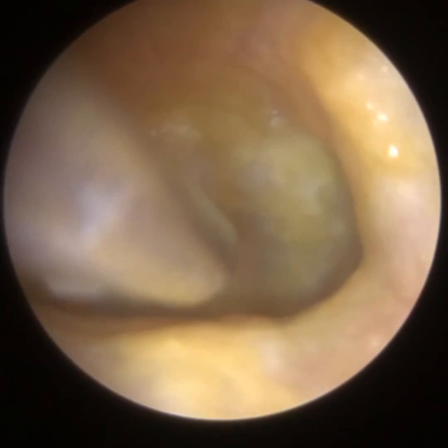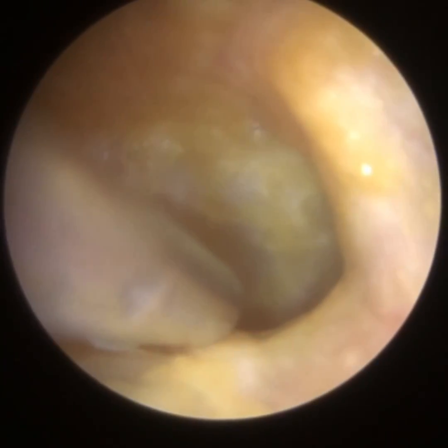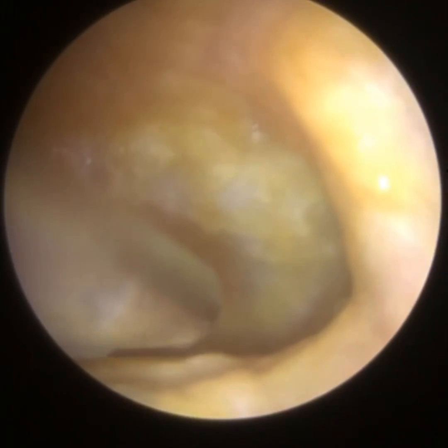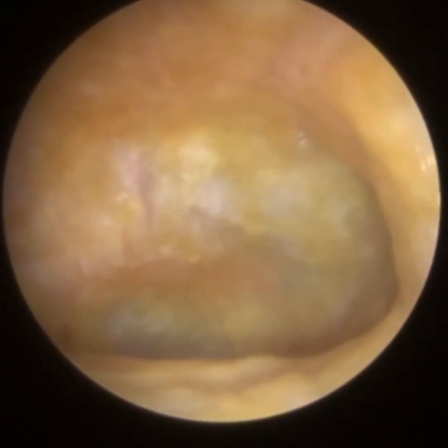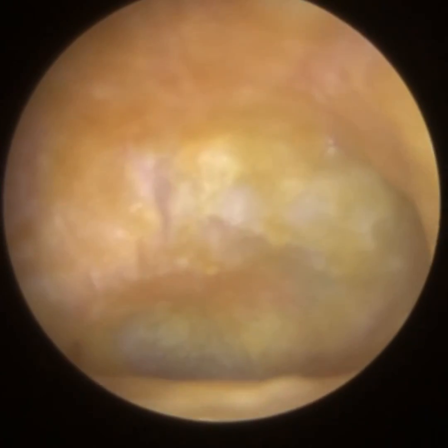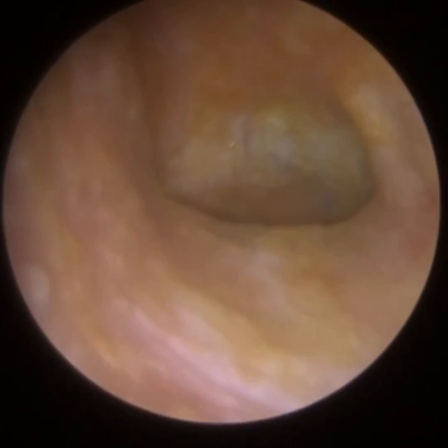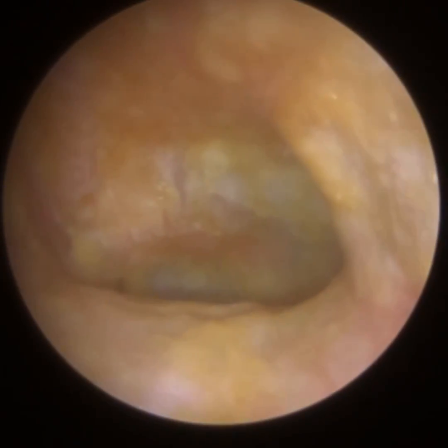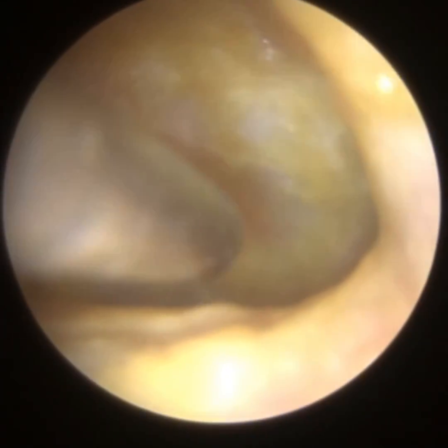So Otomize has a few more ingredients. It not only contains acetic acid, it also contains an anti-inflammatory, and it also inhibits bacterial growth through the neomycin. Aminoglycosides like neomycin are known as ototoxic. If they enter the middle ear, for example if the patient had a perforation and it enters the middle ear and then the inner ear, it can actually cause permanent deafness. So they're typically only prescribed in instances where the patient's eardrum is intact, as in this occasion.